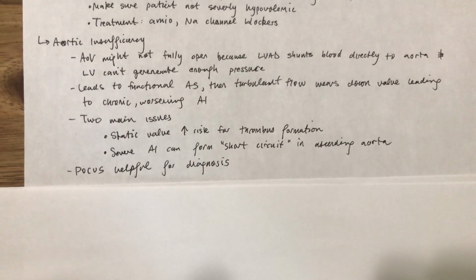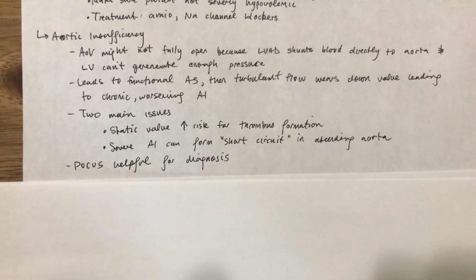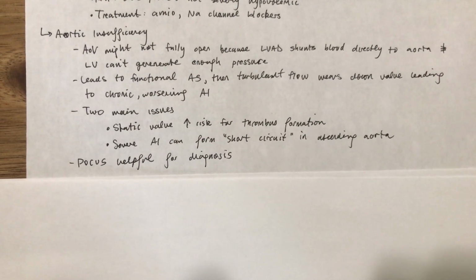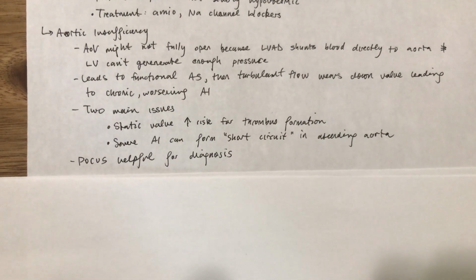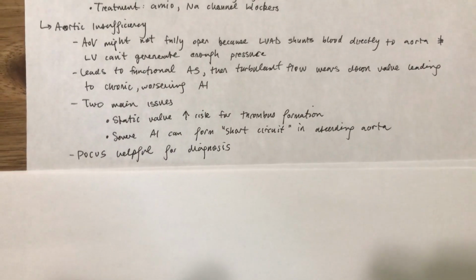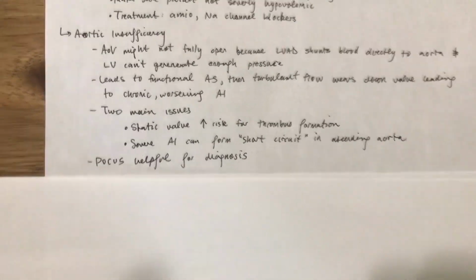And the best way to check this is to just do point of care ultrasound. You can also do a CTA. I think it would be highly unlikely to need a TEE overnight. Usually just ultrasound and CTA is going to give you the answer.